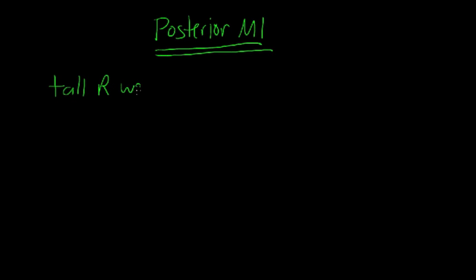Posterior MIs can cause this R wave finding in leads V1 and V2. Posterior MIs can cause tall R waves in leads V1 and V2, and often V3 as well. Basically, they appear as a mirror image of an anteroseptal MI over the x-axis.